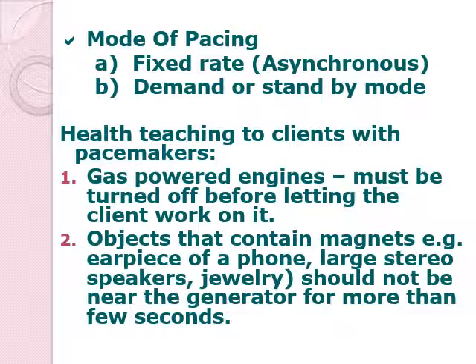There are different modes of pacing. One is your fixed rate, and then the other one is your demand or standby mode. Take note that your fixed rate is asynchronous. Okay, it fires electricity at a fixed rate, regardless of the dysrhythmia experienced by the patient.